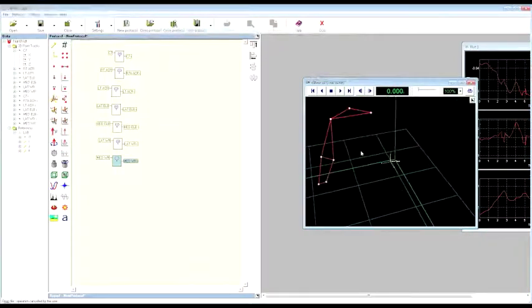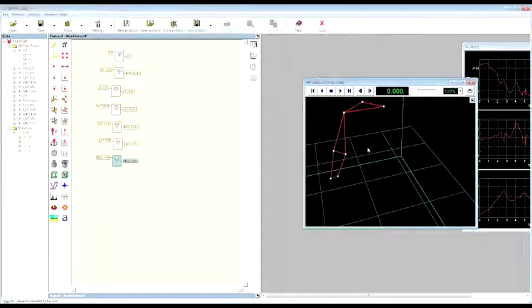But before starting to do that, we need to define some virtual points, because in order to compute this angle, I want to use the right acromion, and then I'm going to use the medial point between the two markers that we have at the elbow level, and I'm going also to compute the middle point between the markers that are placed on the wrist.